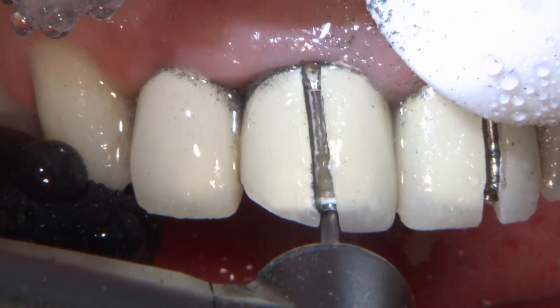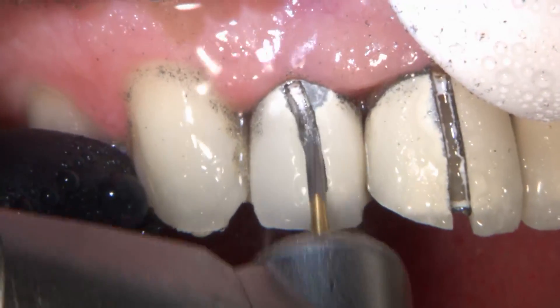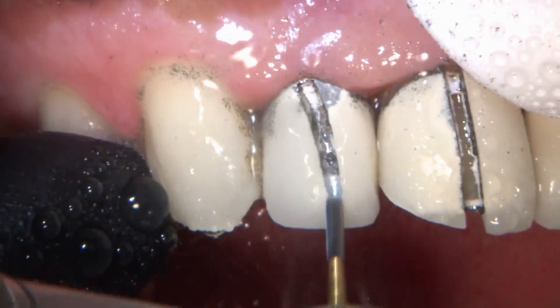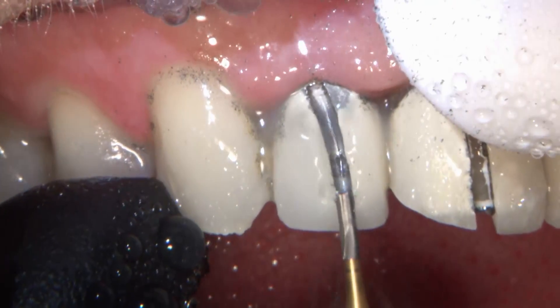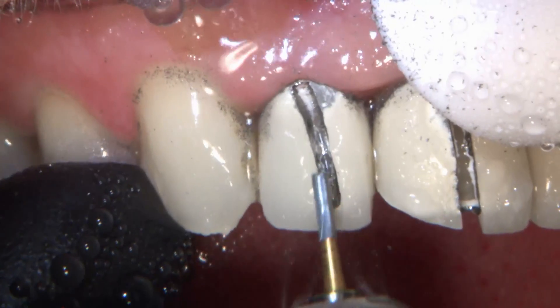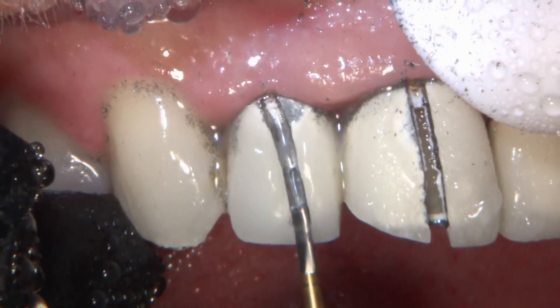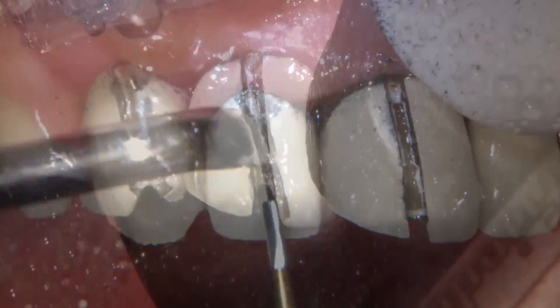It's like a trip down memory lane — almost like pulling out my high school yearbook. That one razor carbide burr will go through the ceramic material and the metal like a knife through butter. Very easy to put a crown remover in there, spread the PFM and take it off. So again, it feels kind of like the good old days.